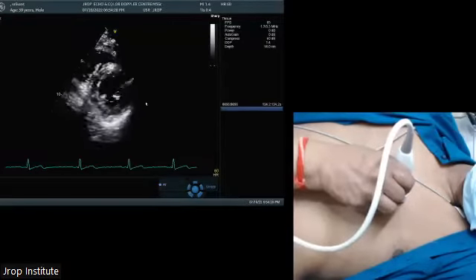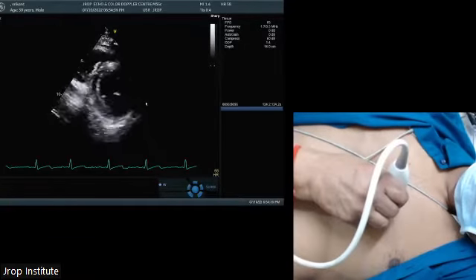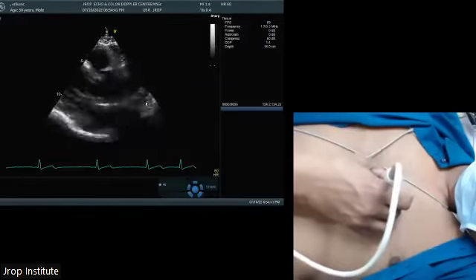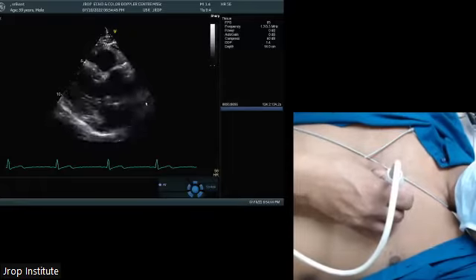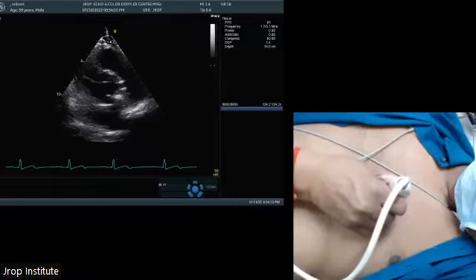These are the 4 cuts of the short axis view at the parasternal window. Okay? And mind my words, I'm perpendicular, I'm not parallel. So in this window, only color would be seen in the pulmonic artery.